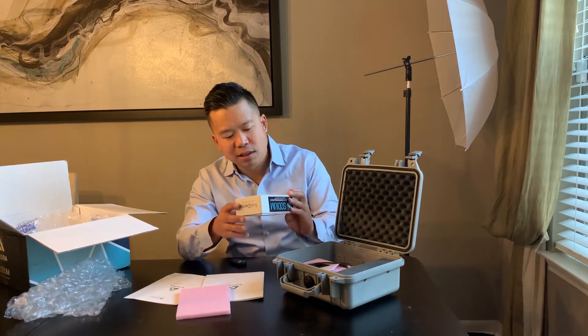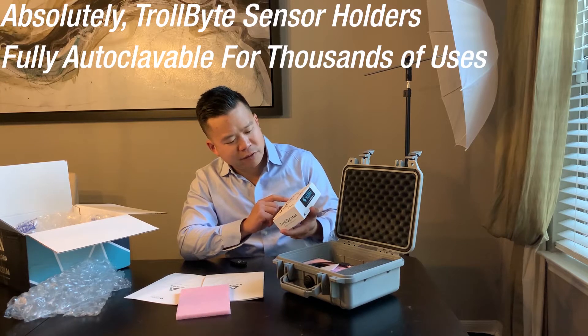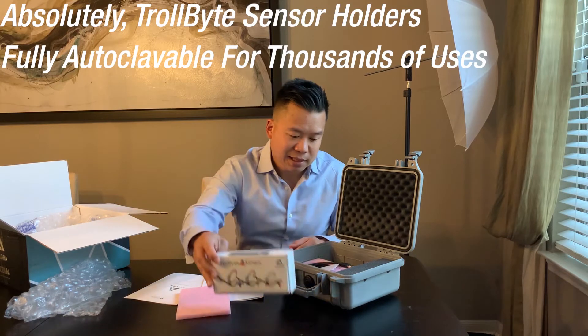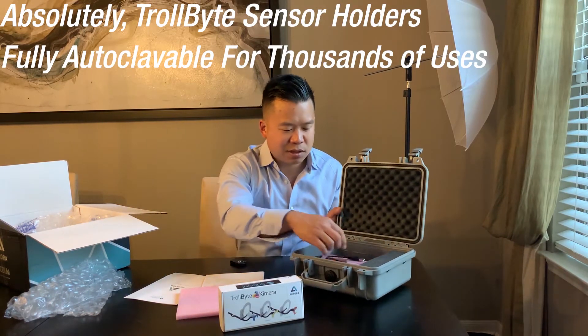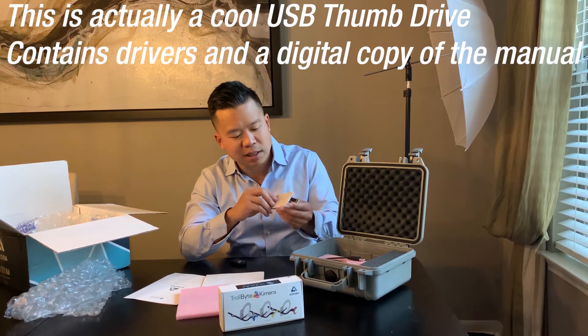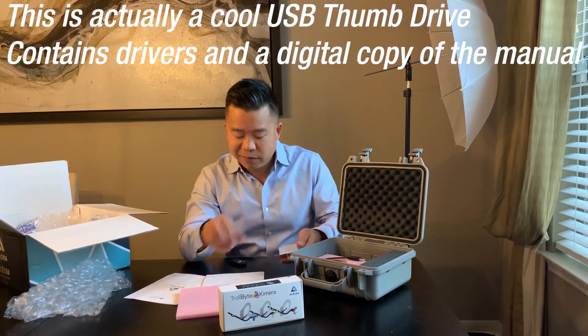We also see these — these are Trollbites: the Trollbite X-ray Positioning Sensor Kit. I've used Trollbites for certain things and they're pretty darn good. I'm not sure if these are reusable, but they look like it — they're probably autoclavable, which is nice. There's also a little plastic piece with what looks like a SIM card — I'm not sure what this is, but I would call Sodium Dental and I'm sure they'd give me some information.